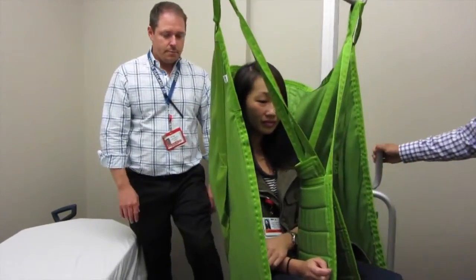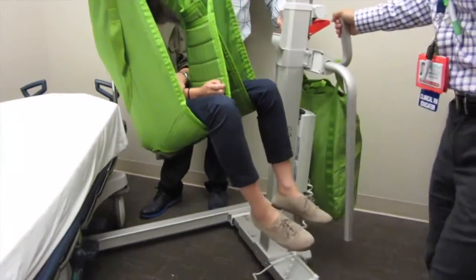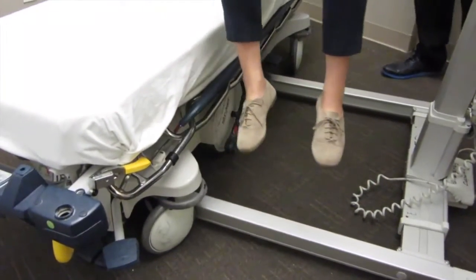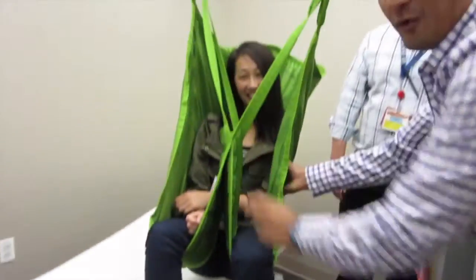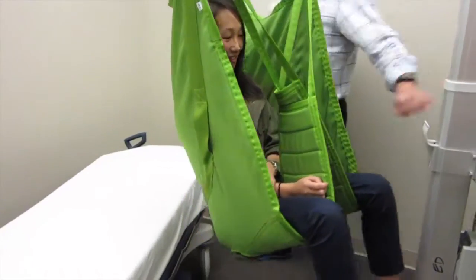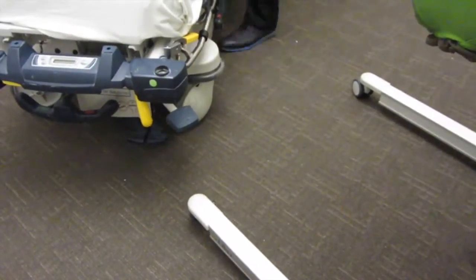You're going to demonstrate that. It's not going to, it just simply will not go in there. No matter how much you try, no matter how much you force it, do not try forcing it in here. And then people try doing other things by tilting this over. Don't want to do that. All right? So what we do is we just pull the Golvo out, coming from the feet, so you don't hit the IV pole that's always at the heads, and then lower down.